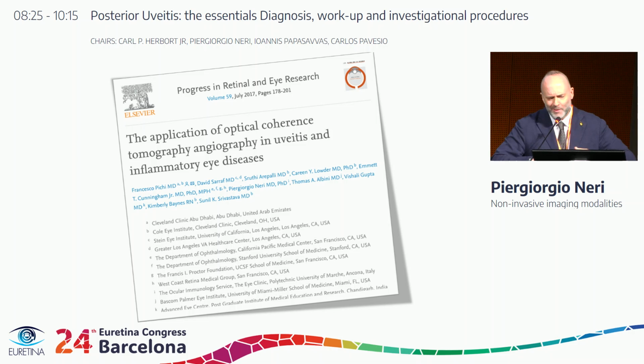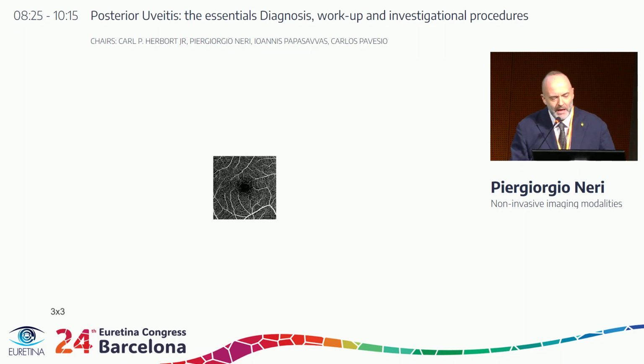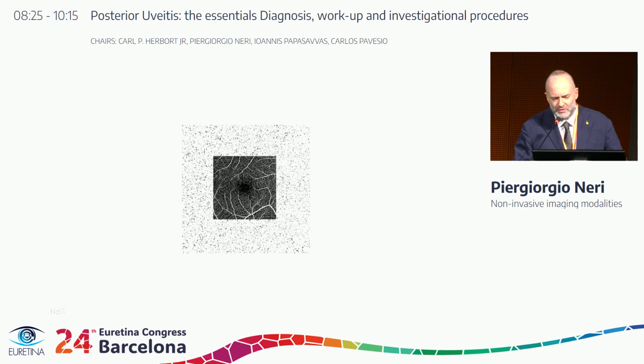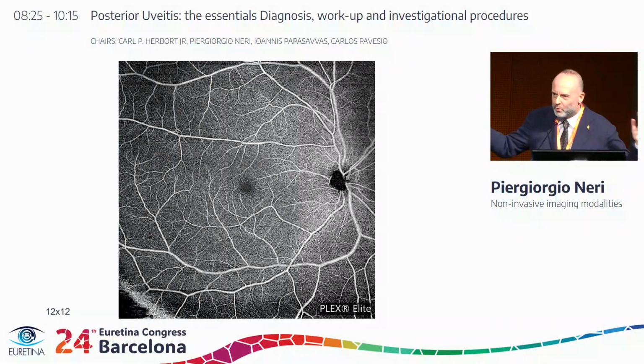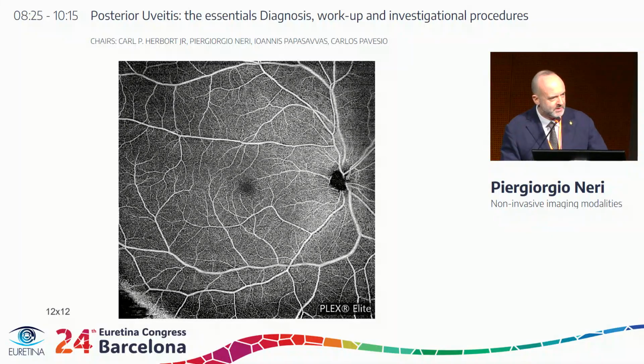Now, the application of optical coherence tomography went broader than the mere B-scan cut, and of course we went from this to this to this, and now we can see an even broader view with the new machines that are able to reconstruct the imaging of the vessels of the retina.